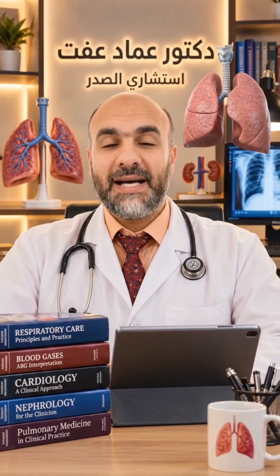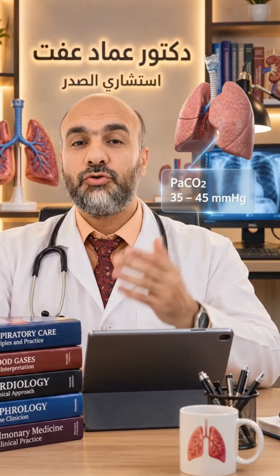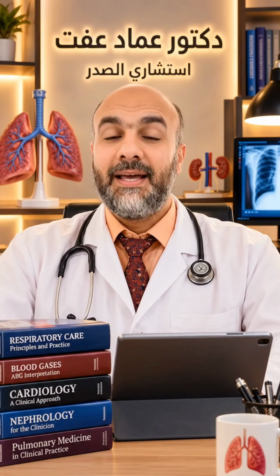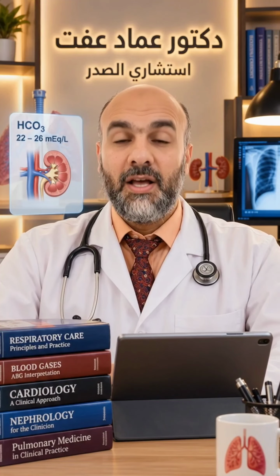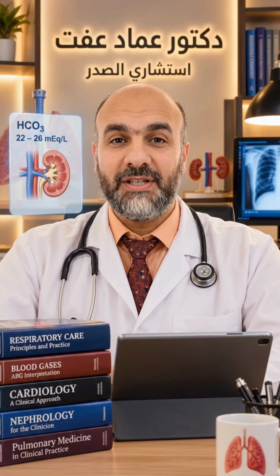Next, check PaCO2. Its normal range is 35 to 45 millimeters of mercury. Now check HCO3. The normal range is 22 to 26 milliequivalents per liter.